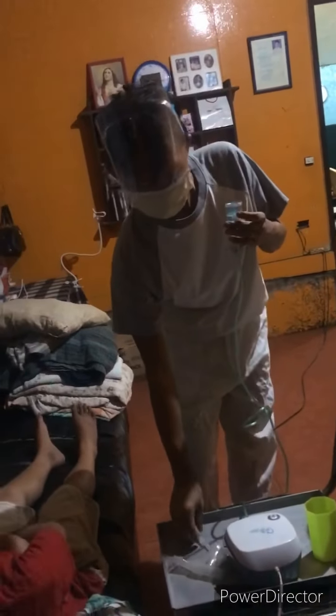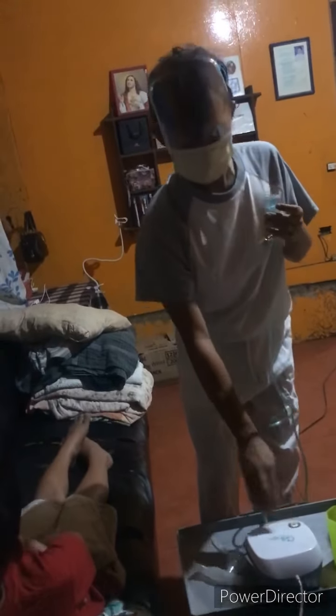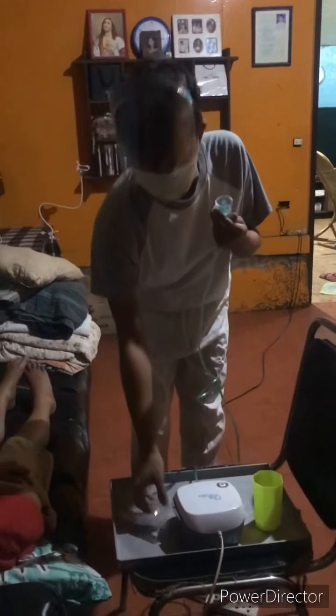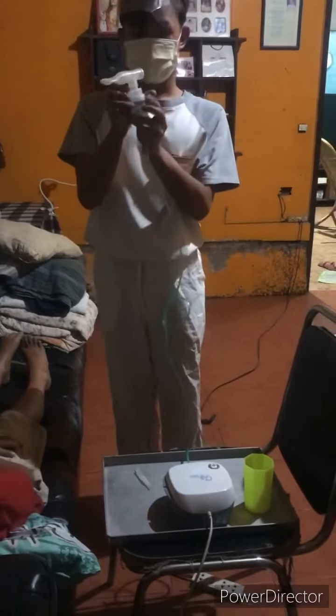Fill the nebulizer cup with the ordered amount of medication. This ensures that the required medication amount is given. Turn on the air compressor. Observe the fine spray from the nebulizer to check that the equipment is working.